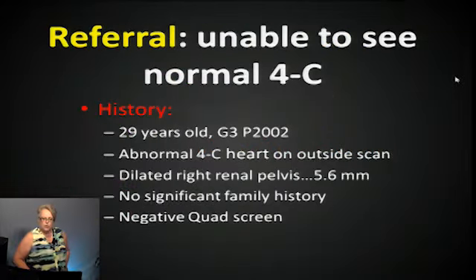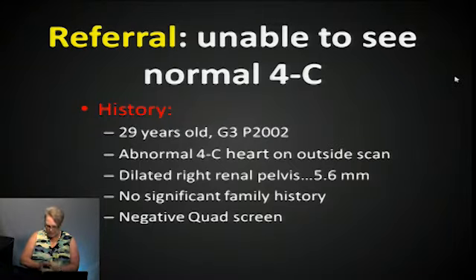So this one was a referral for just can't see the four-chamber heart. And if you're doing screening ultrasounds and you can't see a normal four-chamber, you've done your job. Your job is to know, does it look normal? Is the heart in the right place? Do I at least see that four-chamber heart and that three-vessel trachea view? If those look normal, you've done your job. And if you can't see that, send them on.